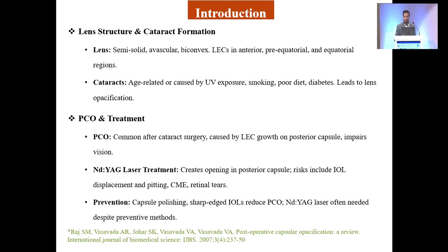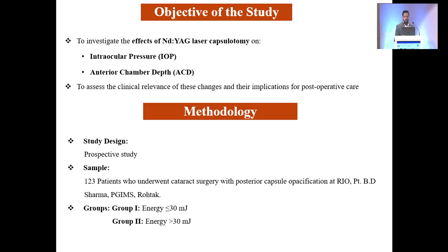The few risks associated with Nd:YAG laser are IOL displacement and pitting, cystoid macular edema and retinal tears. As a prevention of posterior capsule opacification, capsule polishing and sharp edge IOLs can be used, and Nd:YAG laser is often needed despite preventive methods. The objective of my study is to investigate the effect of Nd:YAG laser capsulotomy on intraocular pressure and anterior chamber depth to assess the clinical relevance of these changes and their implications for postoperative care.